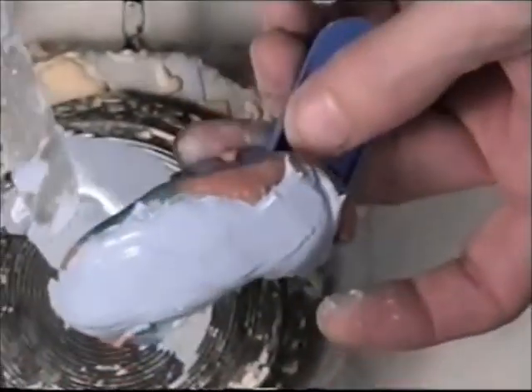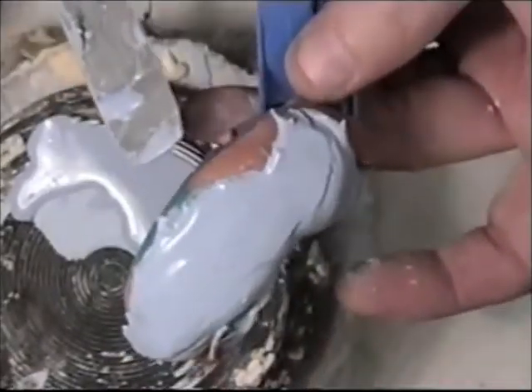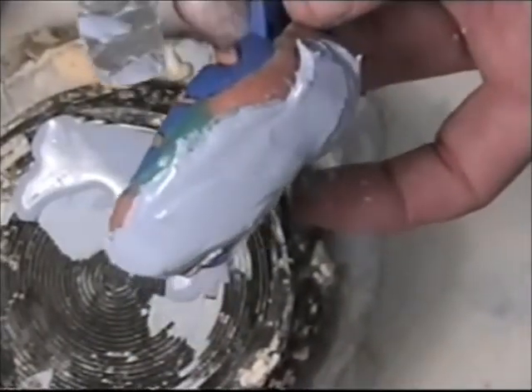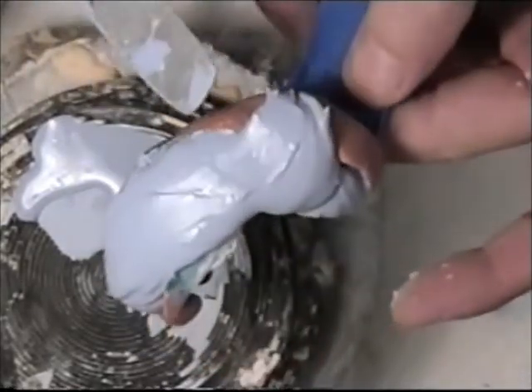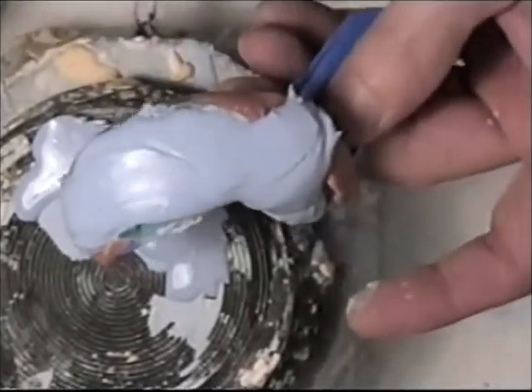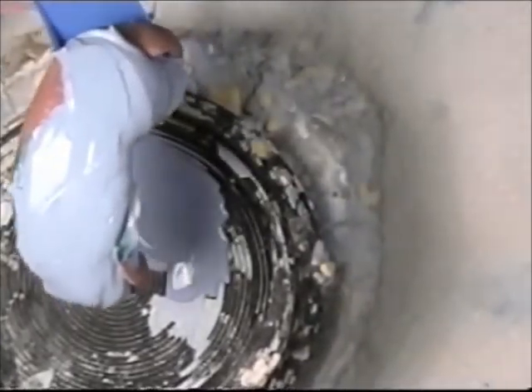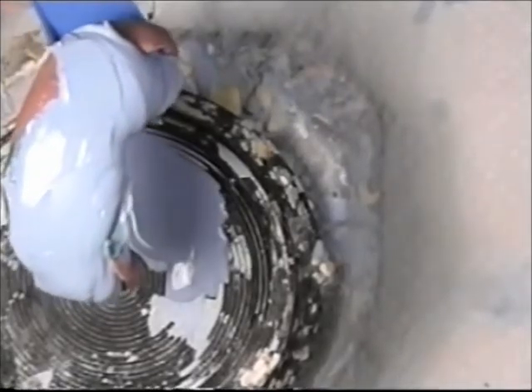Try not to pour your stone over the impression too much. You don't want to especially pour it over the tray — if you do that, it will be hard to separate. So that's all I need to do, and I'm going to let the stone set up in these impressions for about 15 minutes.